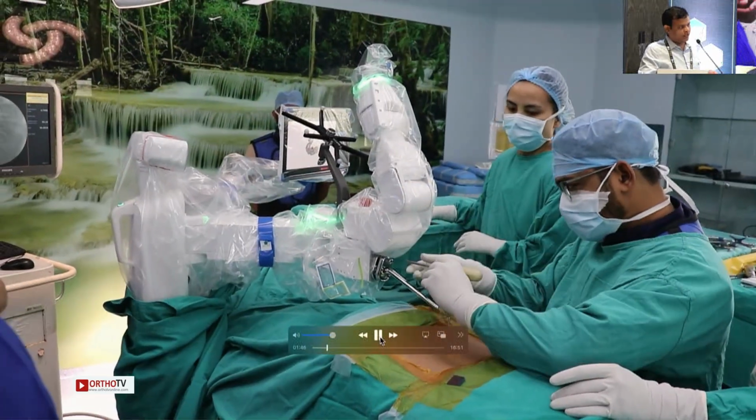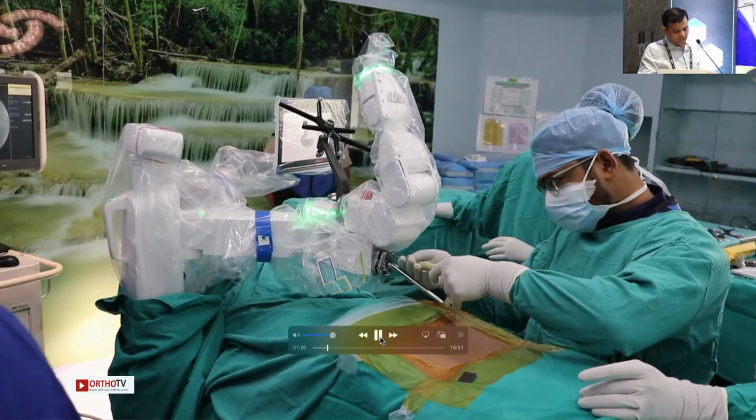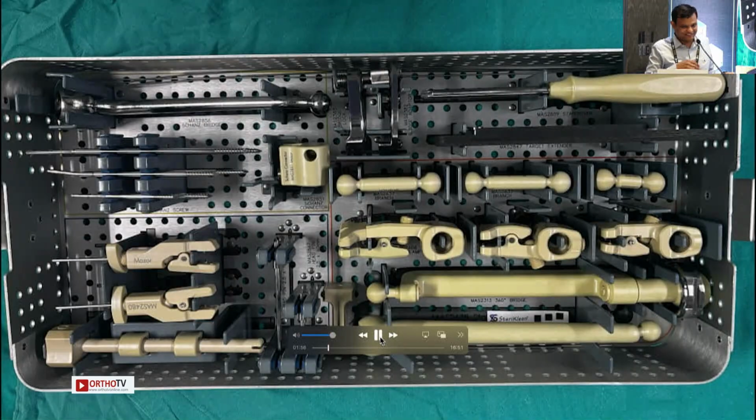So it has again a tracker which is held on to the robotic arm, and the video is slow because I had to present for 30 minutes. I thought, what will we present? So it will keep on running. I'll ask you a question.